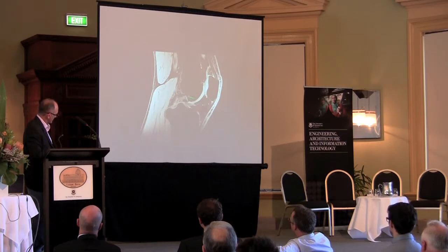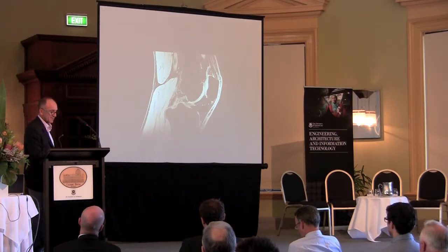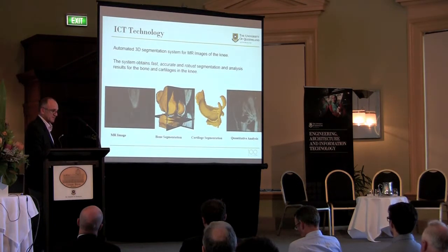And coincidentally, once we had this sort of technology working and these sort of images were available, and this is a sagittal scan through the knee, that's your kneecap there, and this white stuff here is the articular cartilage on the joints, the patellofemoral joint there. And osteoarthritis and acute injury injures that, and you can detect it very clearly. Other manufacturers then became interested in these sort of scans and said, well, are you able to pull out maps of this cartilage, and could we use that as a biomarker for things like osteoarthritis or sports injury. And so even though it was a GE system, Siemens were interested in doing this.